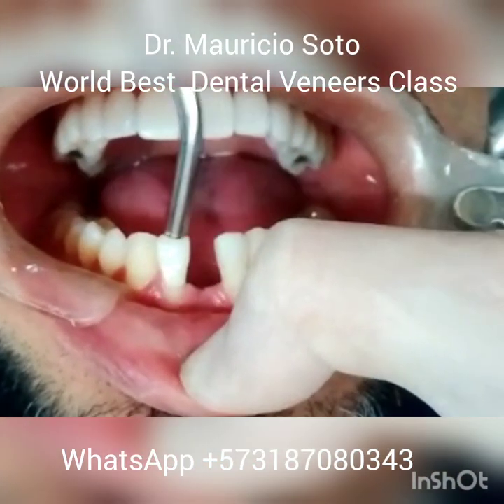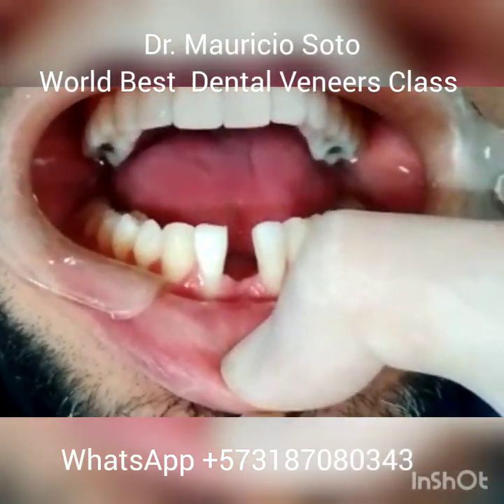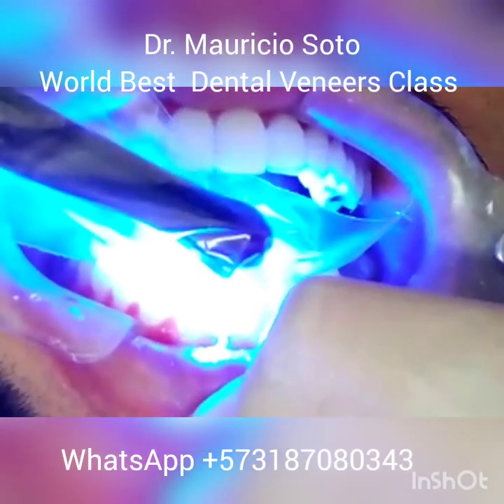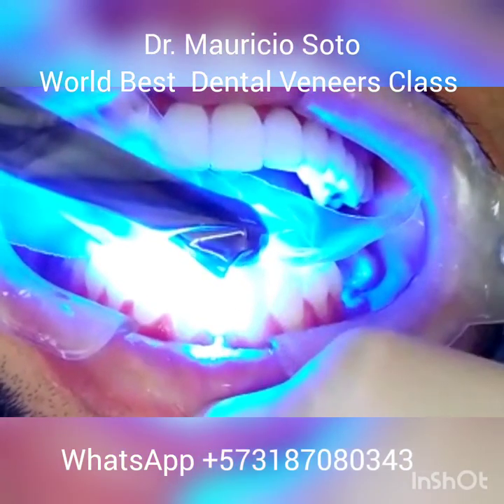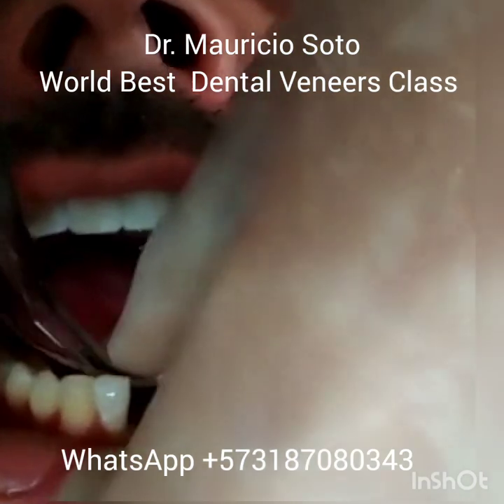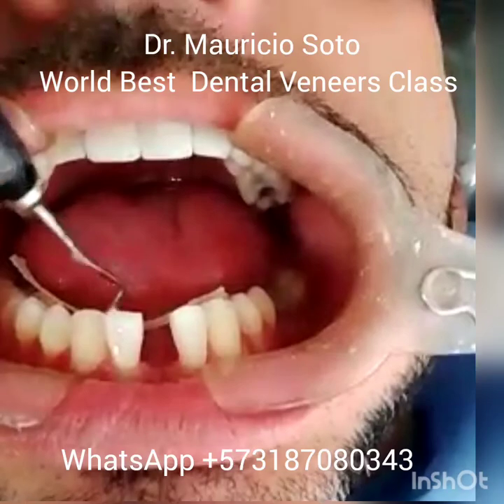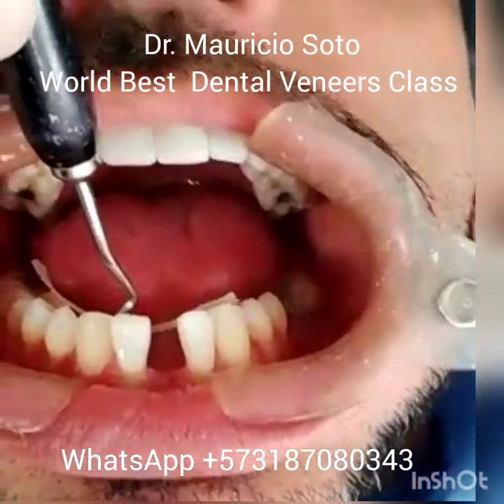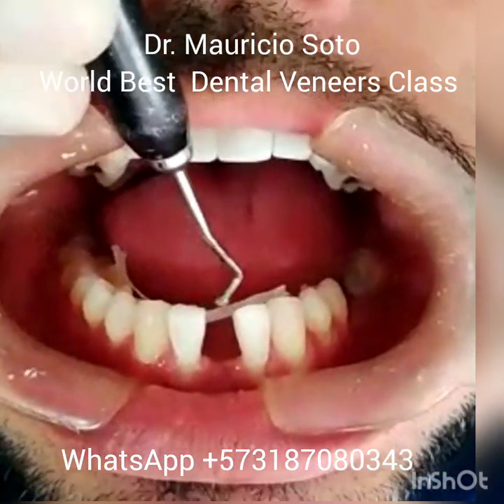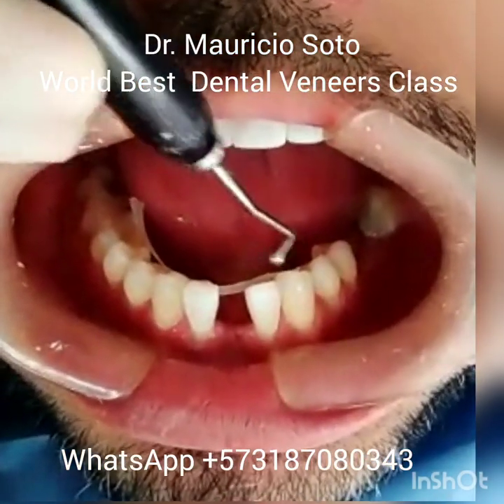After this, dry a little to spread the bonding in a better way. Remember to photocure the bonding for about half a minute. Now you choose a piece of dental fiberglass and adjust it to the length that you need to put the dental tooth over the fiberglass to replace the missing tooth.